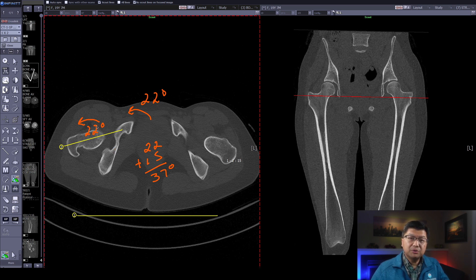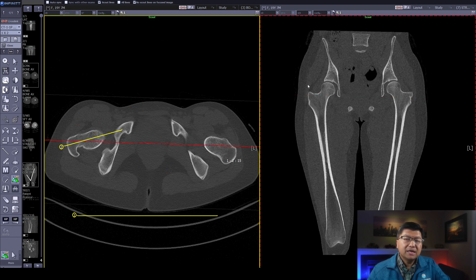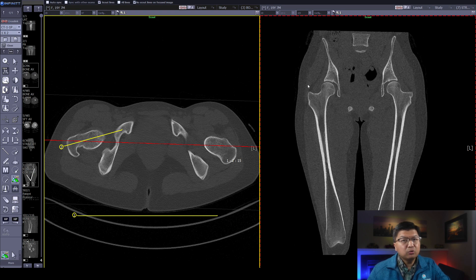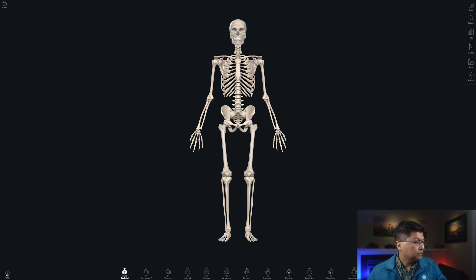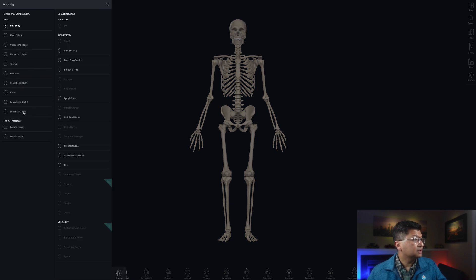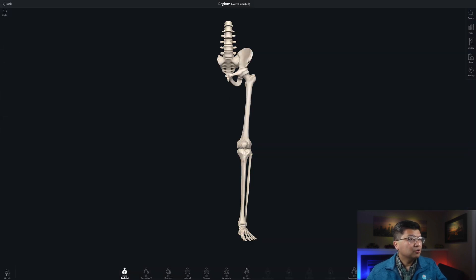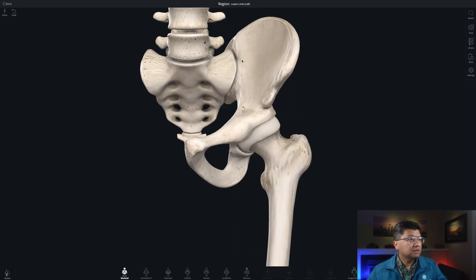Now let's move on to measuring the femoroacetabular alpha angle. Before we actually make the measurements, I want to show you a little bit of 3D anatomy to give you an idea of exactly where we're making that measurement and why. Here's a 3D model of the bones — I'm going to show just the pelvis and the femur, concentrating on the left lower limb, and zoom in to give you better anatomical detail.